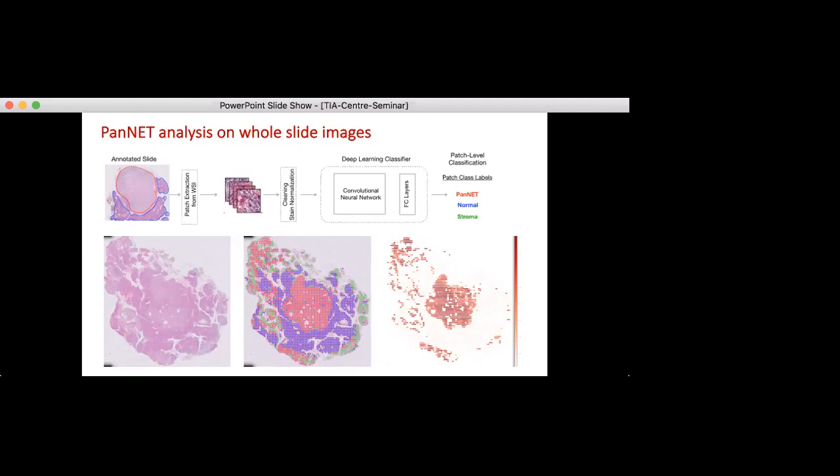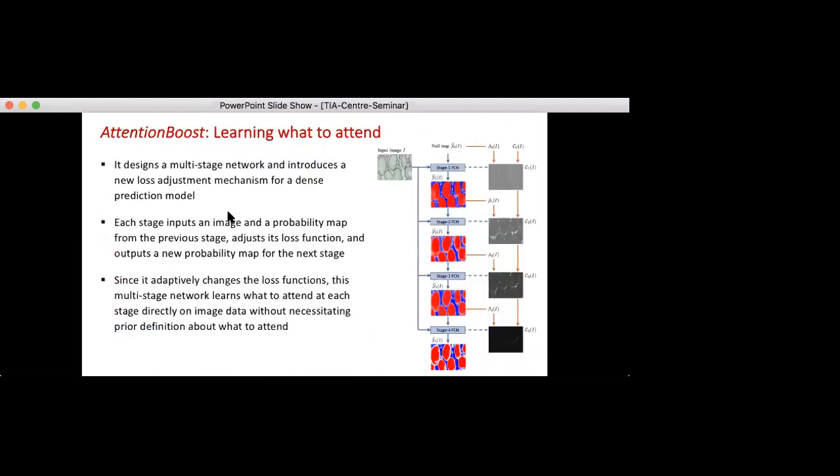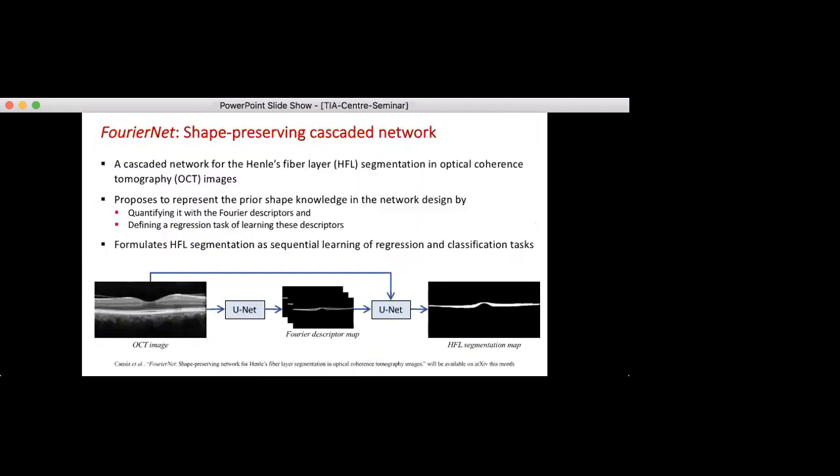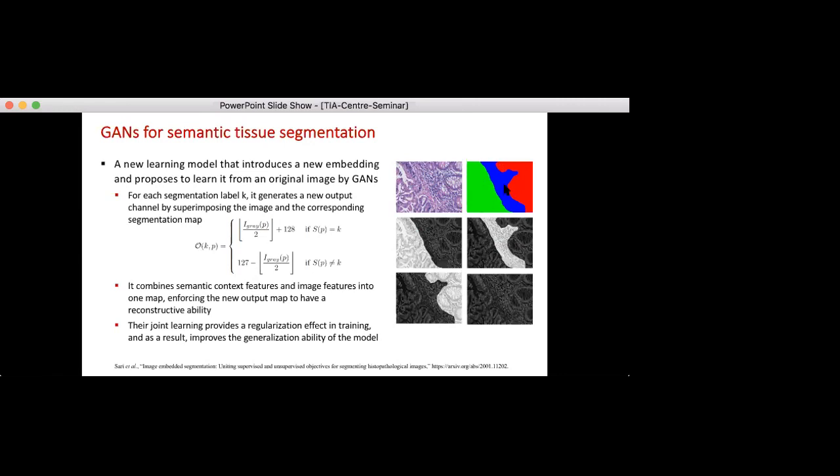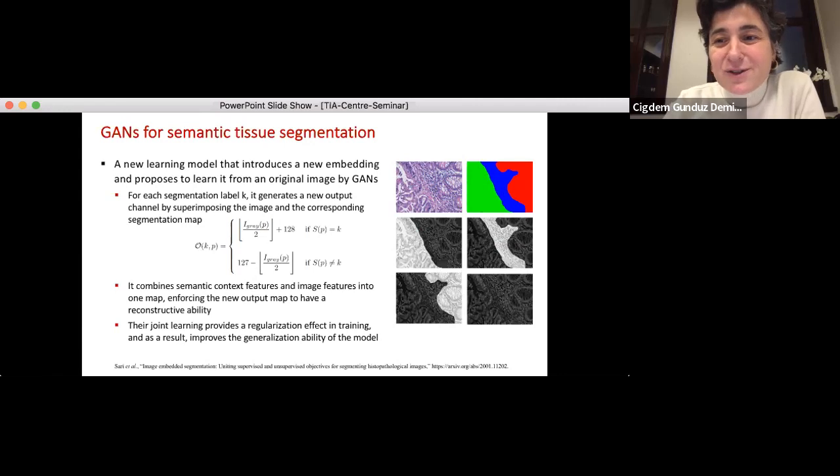So for GAN-based segmentation, did I get it right that you use intensity maps, just grayscale inputs to the network, or am I wrong? So the input map is a 3-channel map, an RGB image. And in that case, we have, suppose, 4 segmentation labels.